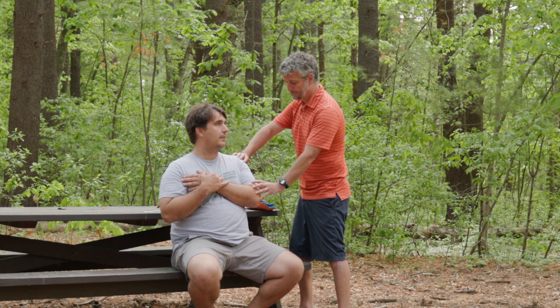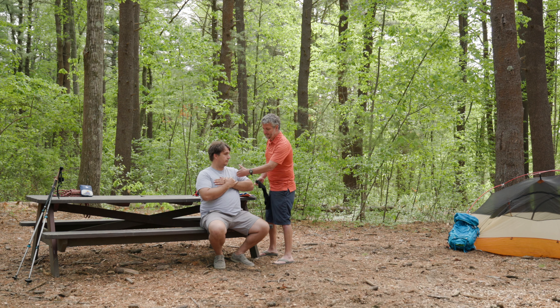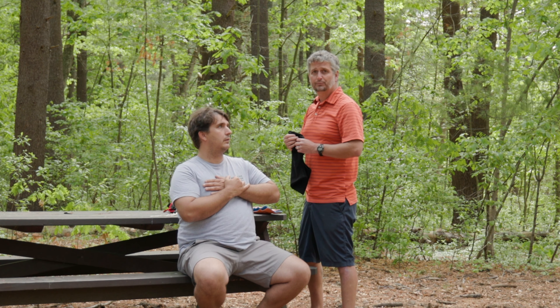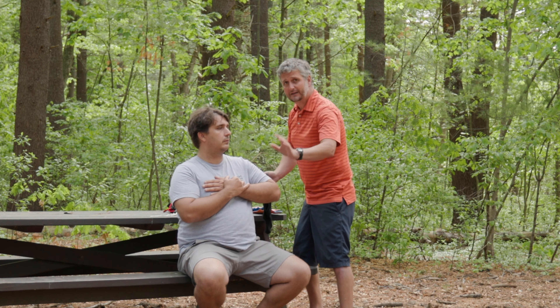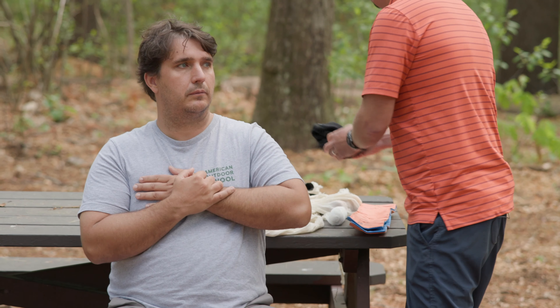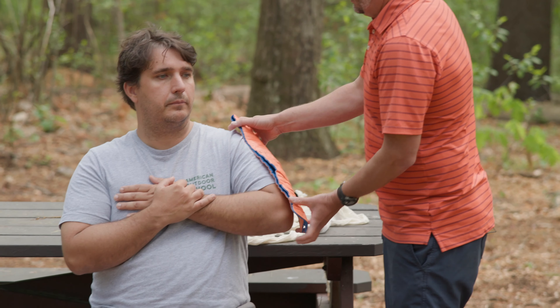Once I have all my material ready, I'm going to have my patient move their arm slightly out so that I have space to work. I want to add a bit of padding underneath between the arm and the patient's chest. This is going to add a little room so that as the patient breathes, it's not putting too much pressure on the arm. I'm going to leave it out right now simply so you can better see how we build this splint.